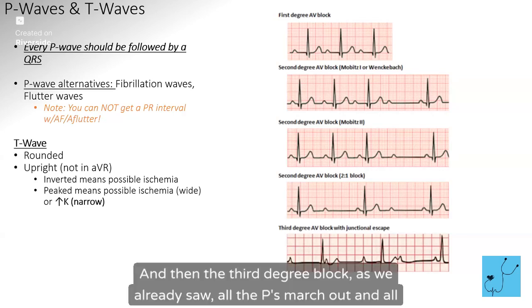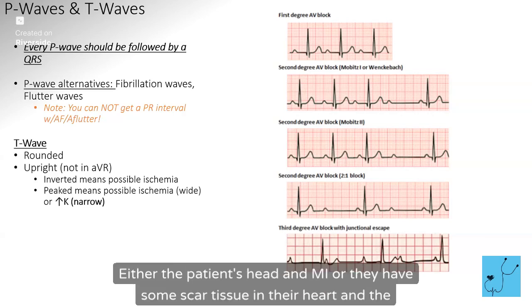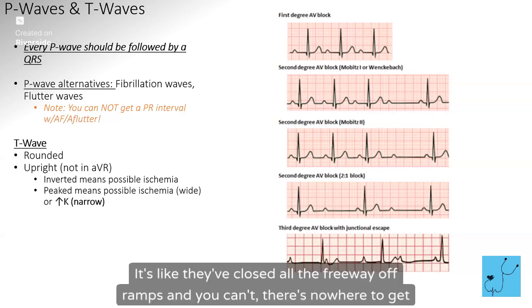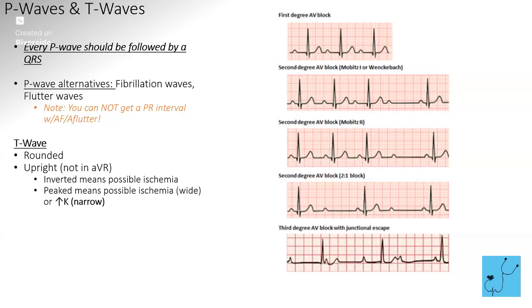And then the third degree block, as we already saw, all the P's march out and all the QRSs march out, but they don't do it together. There's no rhyme or reason. Either the patient's had an MI or they have some scar tissue in their heart, and the message from the atria cannot get through. It's like they've closed all the freeway off ramps and there's nowhere to get off, so it can't make it to the ventricle. And it makes the junctional escape because that first QRS doesn't have that P, right? Correct.